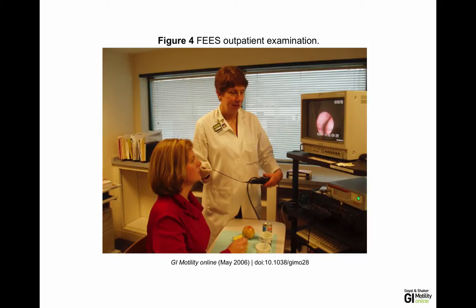Here's the actual setup, and this slide is taken from the Susan Langmore article that is posted on your website for you to take a look at, and I highly recommend that you review that article. There's film footage as well as a very detailed explanation of what this technology is like.